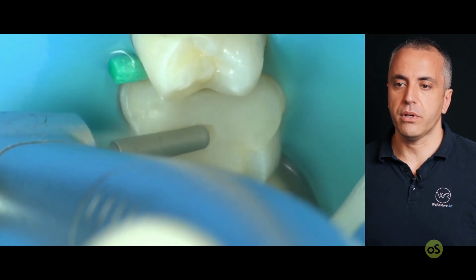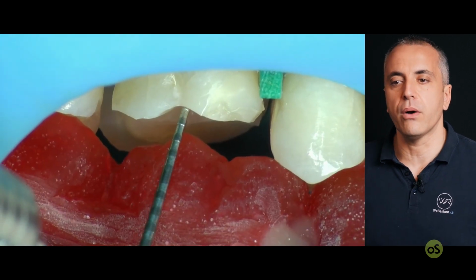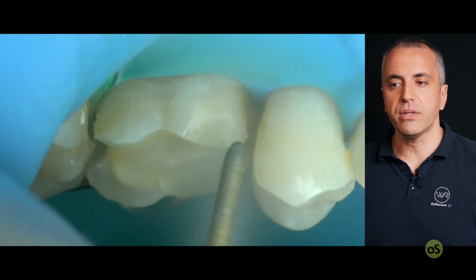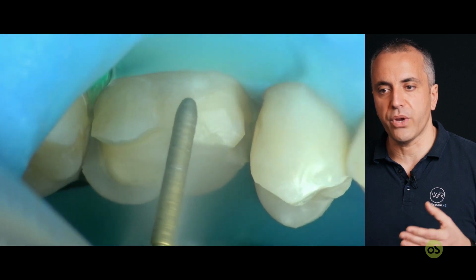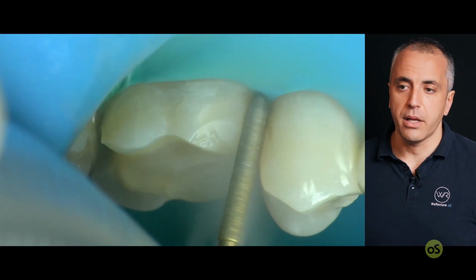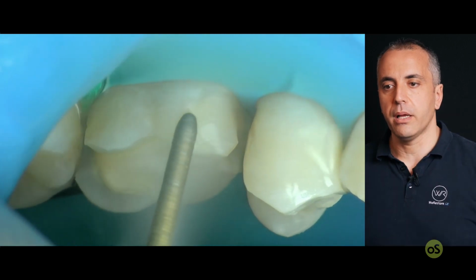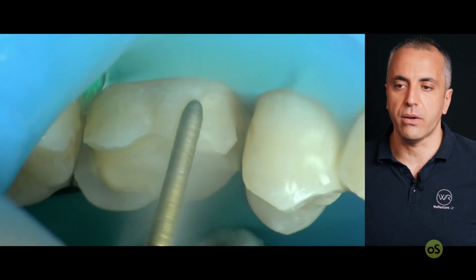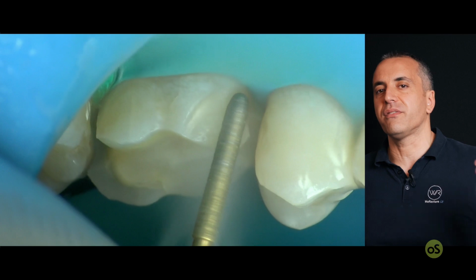It takes some time, so you can speed up very much, but the important thing is to provide the correct thickness. Look now with the probe, now we have a uniform thickness. Now it's time to connect the faces, so to connect the buccal face with the interproximal area. This is a chamfer, but the important part is the head of this burr, which provides a rounded shape of the restoration. Why do we want a rounded shape and not a flat one?